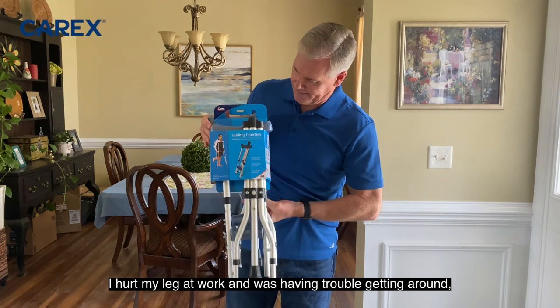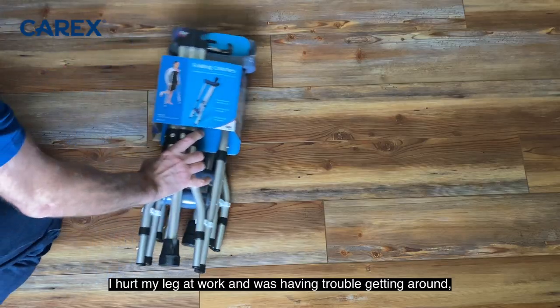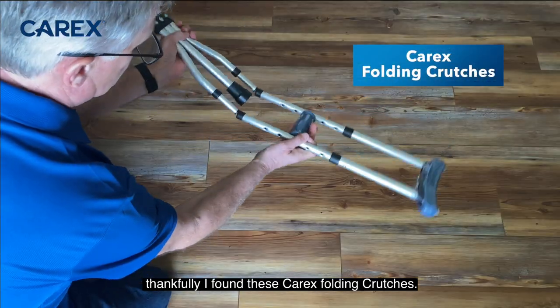I hurt my leg at work and was having trouble getting around. Thankfully I found these Carex folding crutches.